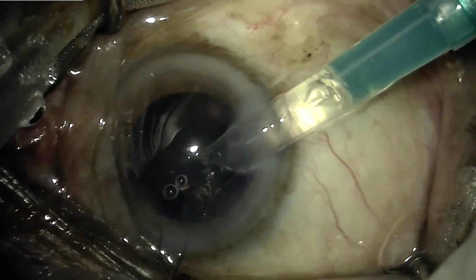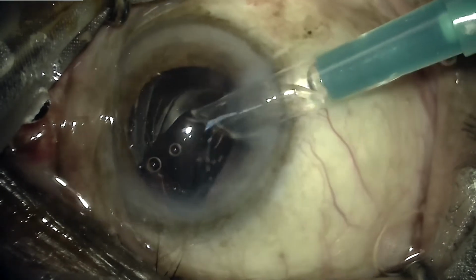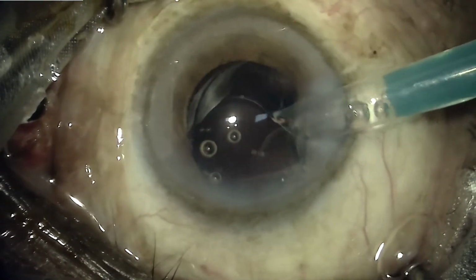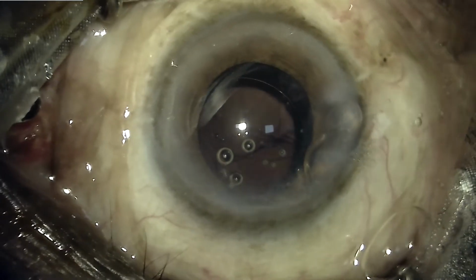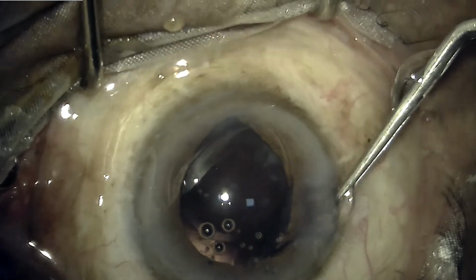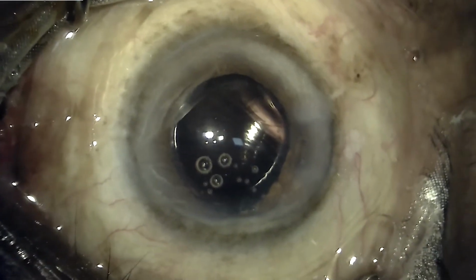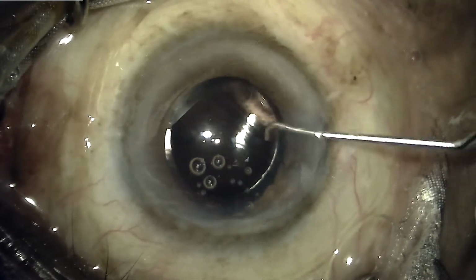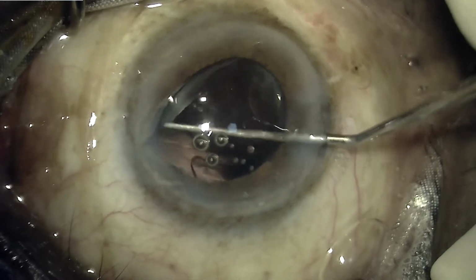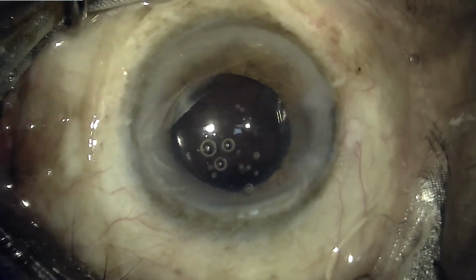Once the leading haptic is placed in the sulcus, then very carefully the optic and the trailing haptic are projected inside, and we can see the trailing haptic being placed inside the eye and being dialed into position. It's very important to make sure that there is no vitreous extending from the rent towards the wound. That can be the cause of future complications including retinal detachment and endophthalmitis.